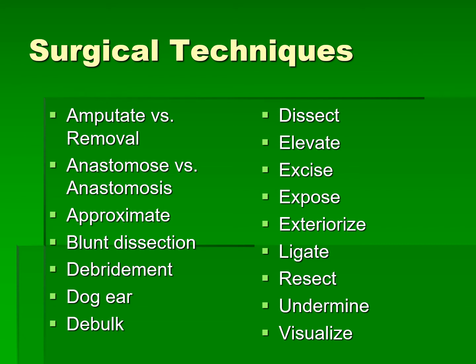When we're elevating something, to elevate means to lift, right? We've all been in an elevator that took us up to another floor in a tall building or a not so tall building, as it were. There are instruments that we use in surgery called elevators. They have kind of a sharp dissecting edge.